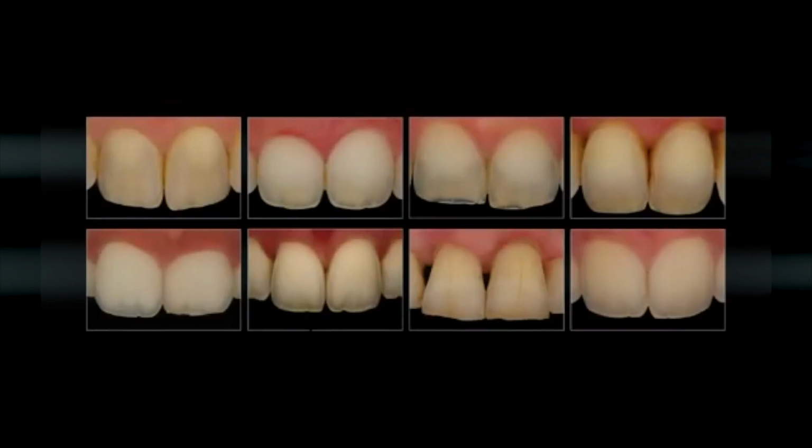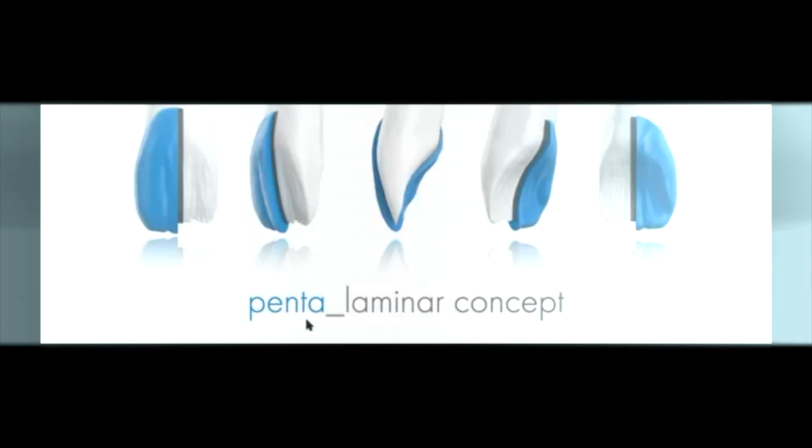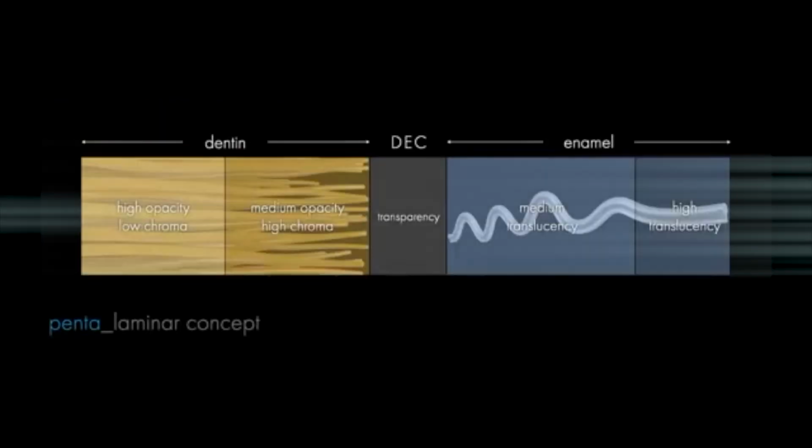So we've done a lot of analysis of natural teeth, not extracted teeth, but real natural teeth in the mouth of patients, in order to understand this kind of thing. And we developed this Penta-laminar concept, which is basically a layering concept that tries to mimic all the different substrates that we can find in a tooth.